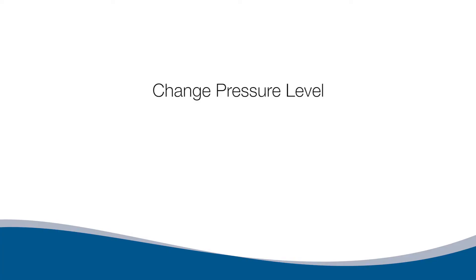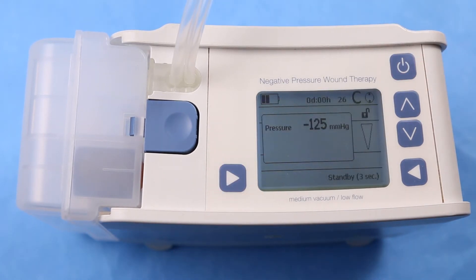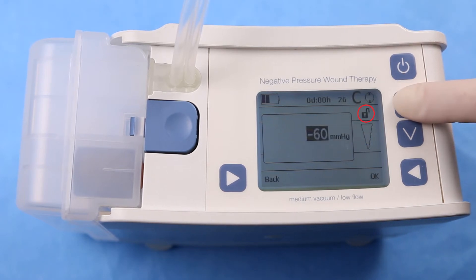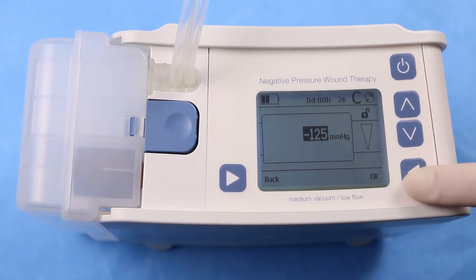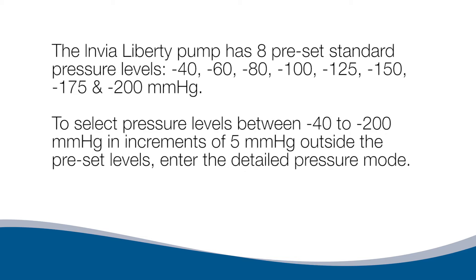To change the pressure level, the pump must be placed in Administrative Mode. Press and hold the bottom left button and press the top right button. The up and down arrows may now be used to change the pressure level. Press the bottom right button next to OK to confirm. The pump has eight preset standard pressure levels: negative 40, 60, 80, 100, 125, 150, 175, and 200 millimeters of mercury. To select pressure levels between these in increments of 5 mmHg, enter the Detailed Pressure Mode.